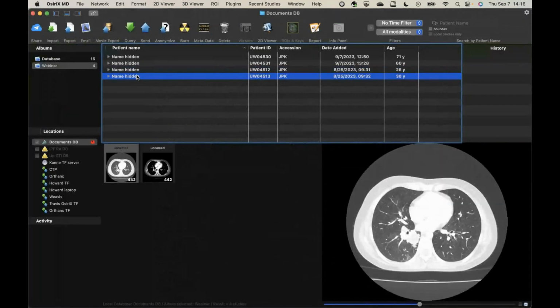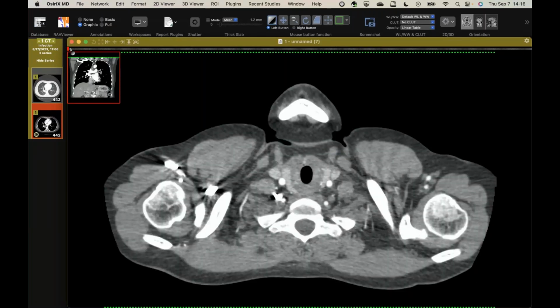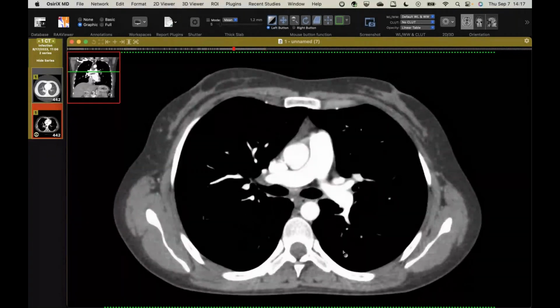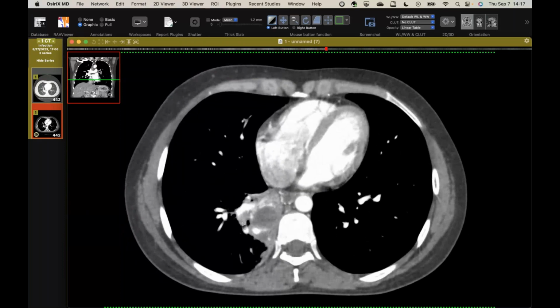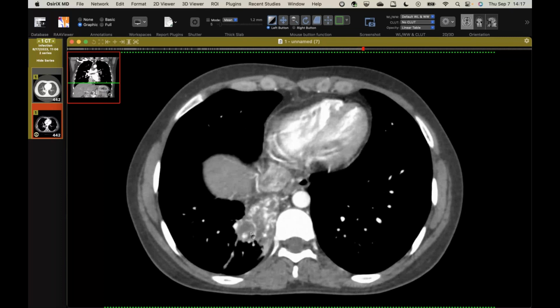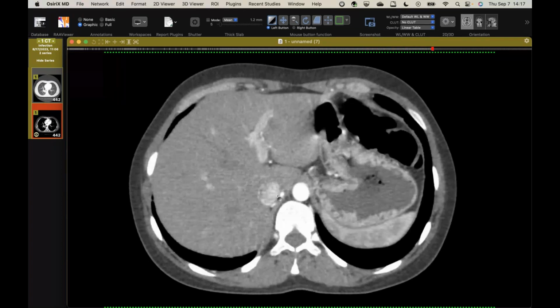Okay, and then this last case, I think you will all like this. I haven't seen a good one of these in a while. This is a 30-year-old who got a CT for a mass, and I don't have the radiograph because it didn't come with the patient, which seems to be the case a lot of times. But young person, and you can see on the right already we see some big bronchial arteries, and we can follow them down here on the right. And then here's this mass, but you'll notice there's a lot of vascularity around it, and it's very low attenuation. And then all of these vessels are being recruited off the inferior phrenic, which is pretty big.